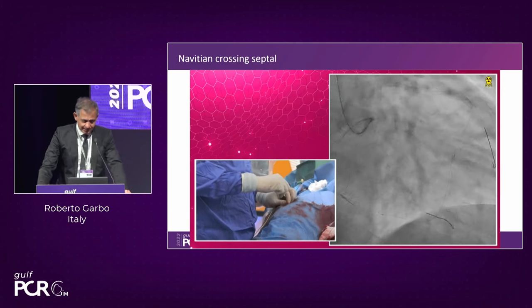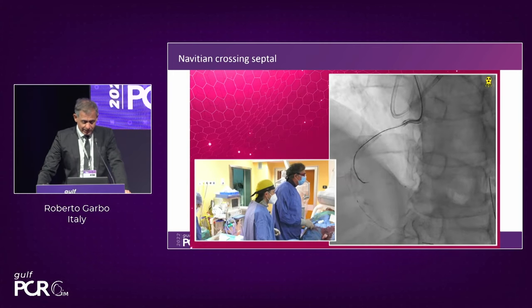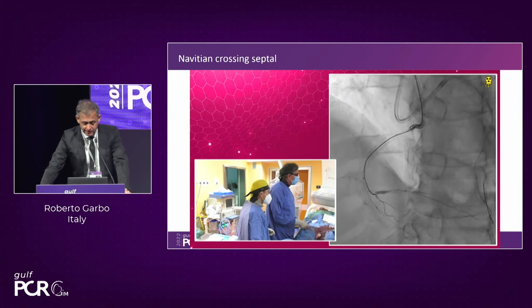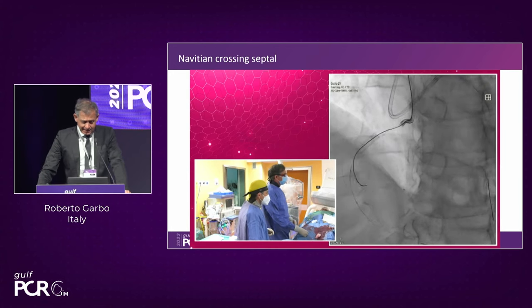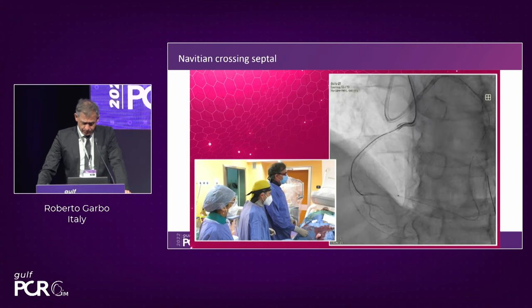And with this movement, we were able to advance. We are in front of the lesion, you can see here. And then at this time, we need to make the connection.